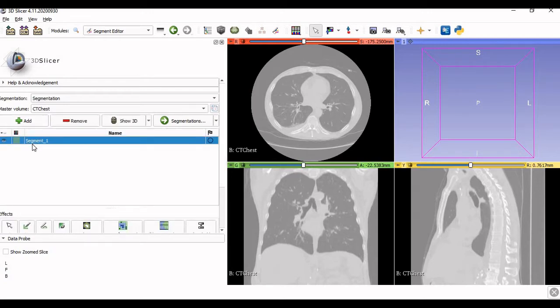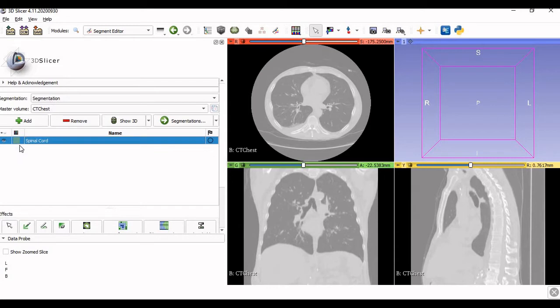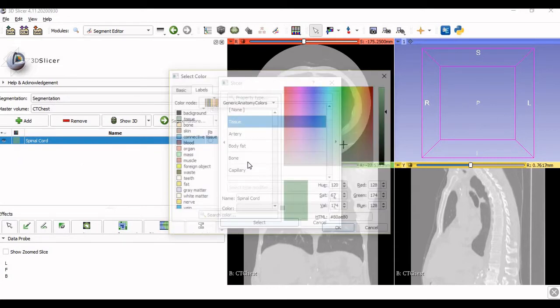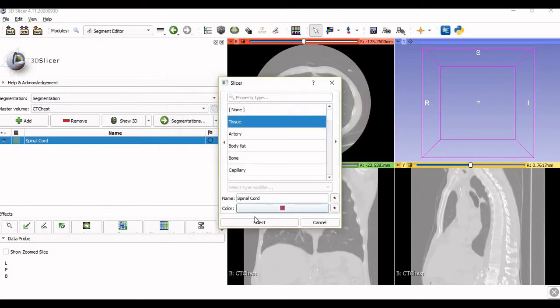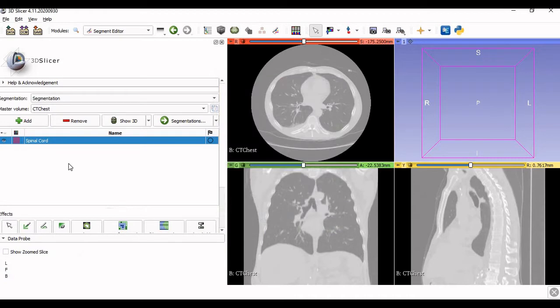You can name this segment as per your convenience. I will try to separate out the spinal cord from the complete chest model, so I will name it 'spinal cord.' You can also change the color so that it is clearly visible. I will give it a bright color so I can clearly see it on screen, then click 'Select.' Once you have named the segment, the task is to separate out the spinal cord from the complete set of images.